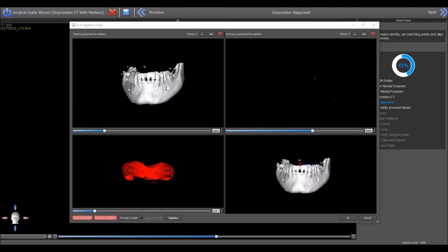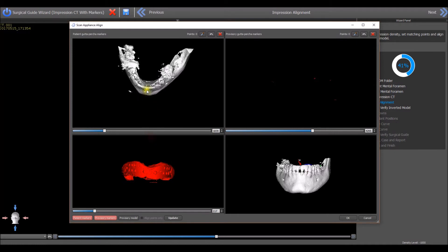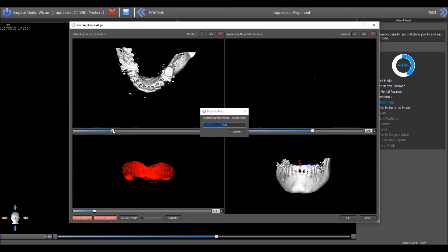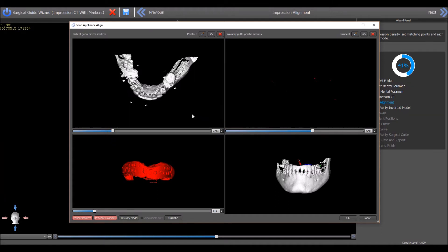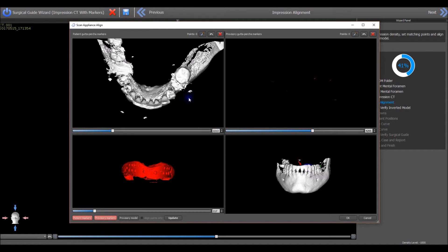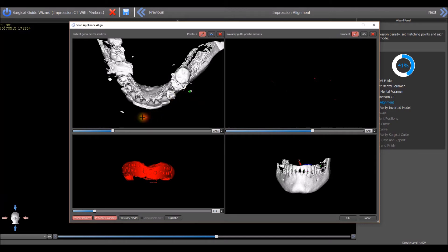This screen allows for aligning of the markers in the Impression Scan to the markers in the Patient Scan. The top left quadrant shows the Patient Scan. Hold the left mouse button and move the mouse to rotate the CT Scan. Move the slider under the image to the right to raise the density threshold and show the relevant markers more clearly. Left-click on the marker icon. Then, while holding down the Shift key, left-click on each of the scanned markers, placing a green dot on each marker.